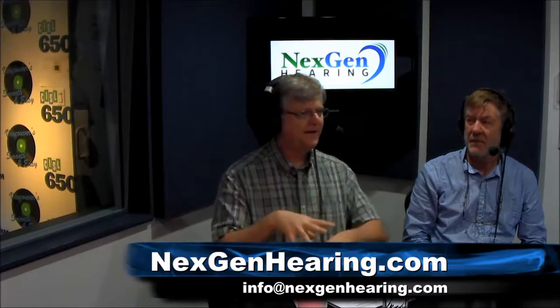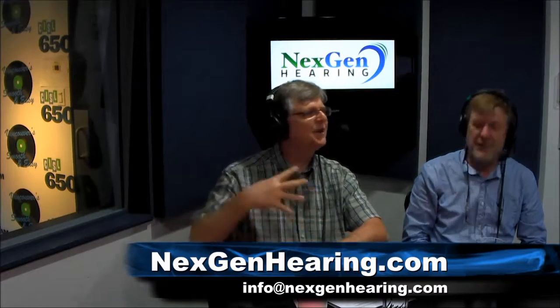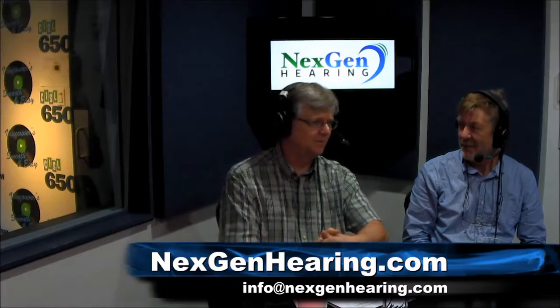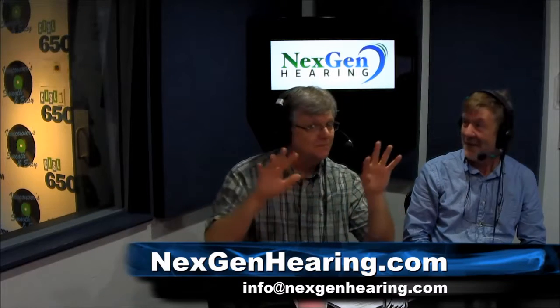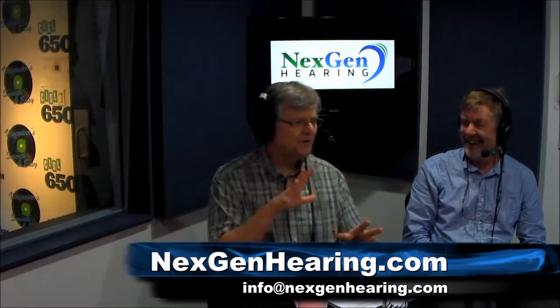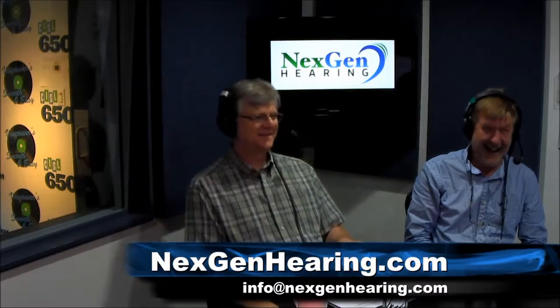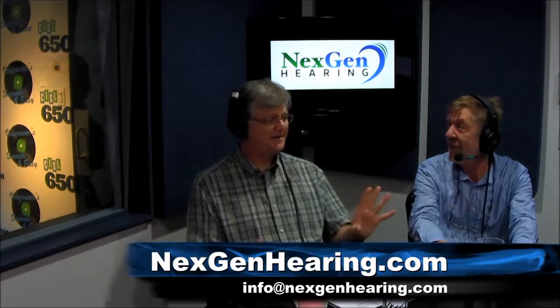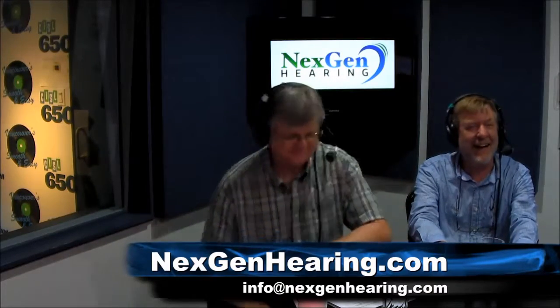But there are applications in the hearing aid to generate sounds that can mask over the ringing, whether it be gentle music or an ocean sound or New Age. Pink noise, white noise. Pink Floyd? Yeah. Pink Floyd. Well, surprisingly, I've had people say, I like the pink sound. Surprised me. There you go.